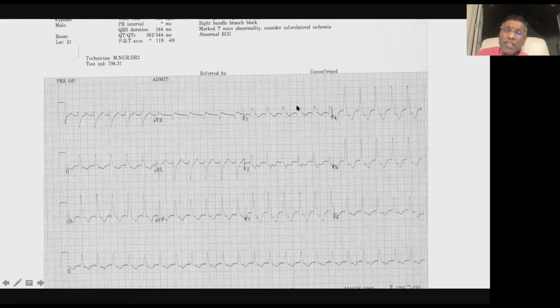That's how you must compare using the different leads. Look at this heavy ECG marker line and follow it all the way down. That's at the tip of the QRS complex here, and if you follow it down, the QRS actually starts to the left of that. So this cannot be the beginning of the QRS complex. This is the beginning of the QRS complex here. So there's an initial Q wave, then R, and R prime being smaller.